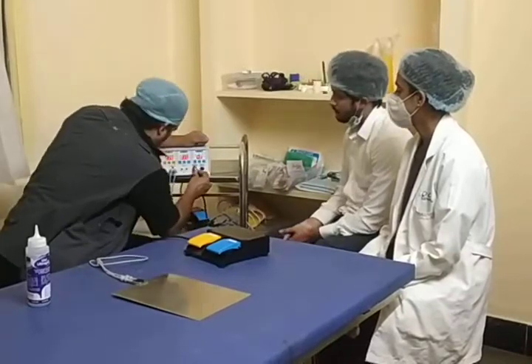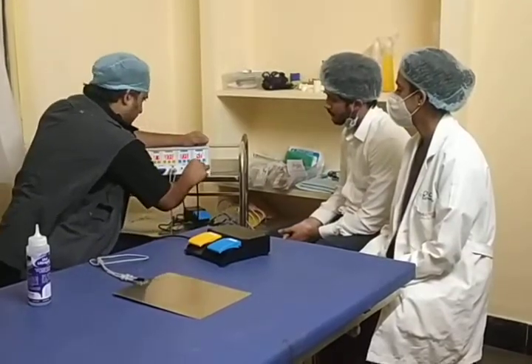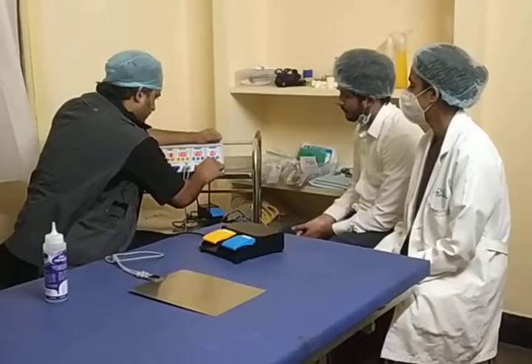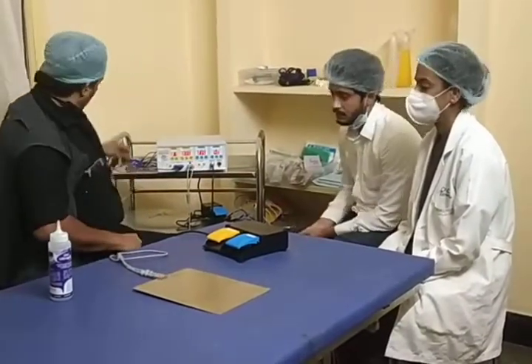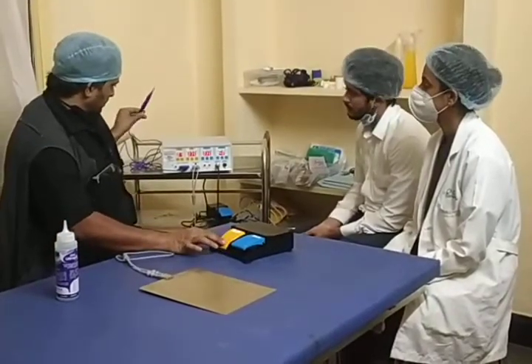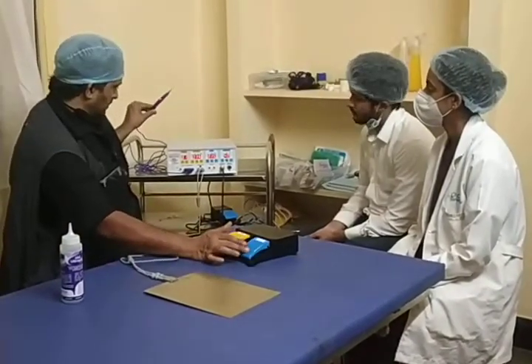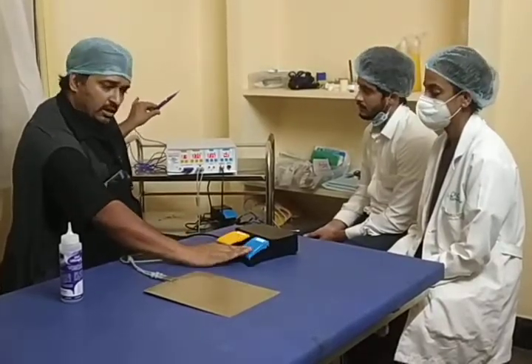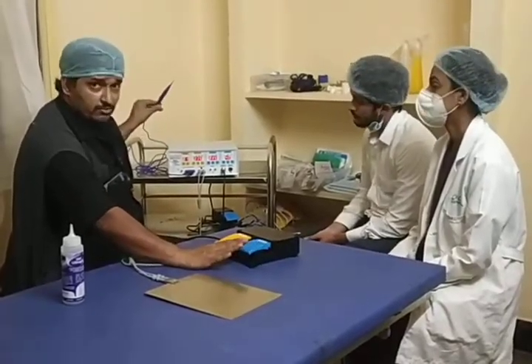Okay, and now I have the switch. So this is the cut option over here and this is the coagulation. Imagine this being the foot, so I can do the cut and the coag. Now this is totally up to the surgeon's preference to see which one he wants to use.